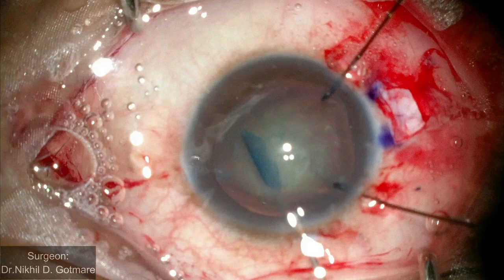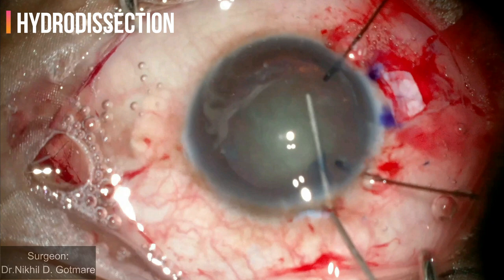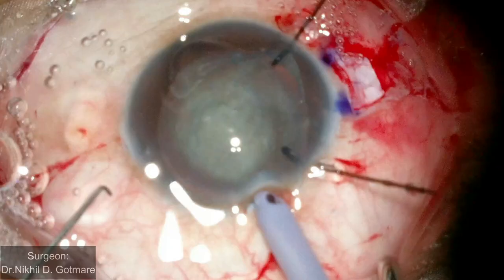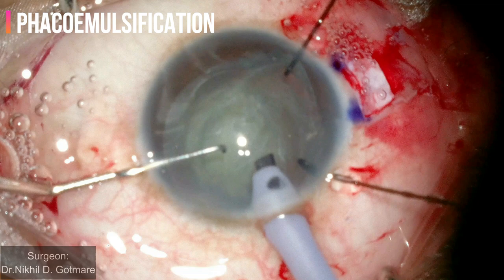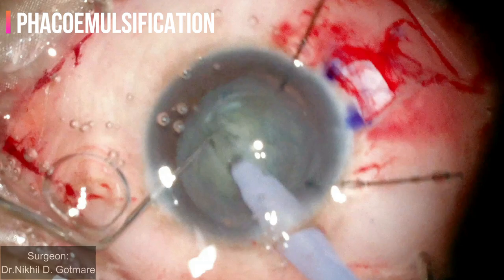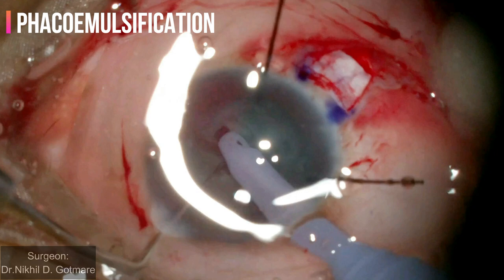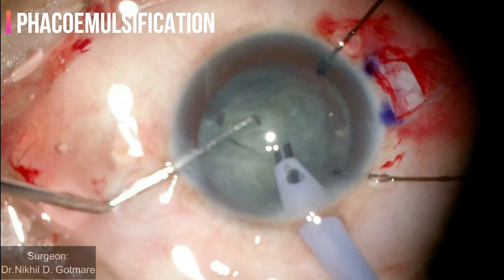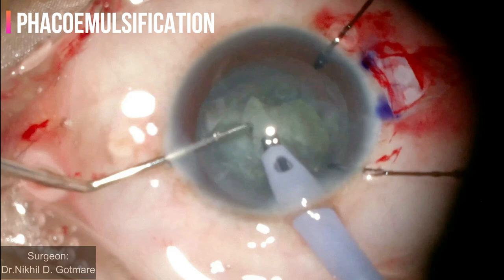A gentle hydrodissection between capsule and cortex is done, followed by delineation between nucleus and epinucleus to obtain a golden ring. Viscoelastic is injected to form the anterior chamber. Nucleus is sculpted to create a trench and then divided into two halves, then emulsified. Parameters are kept low to avoid IOP rise which can cause stress over zonules. Emulsification is carried out in the pupillary plane, as in-the-bag emulsification may cause zonular stress.